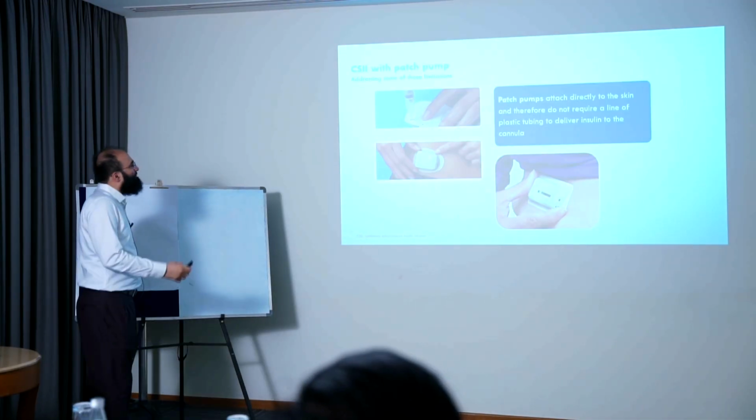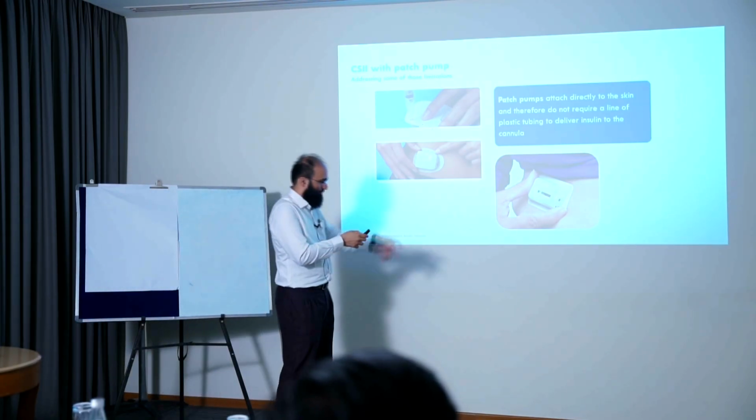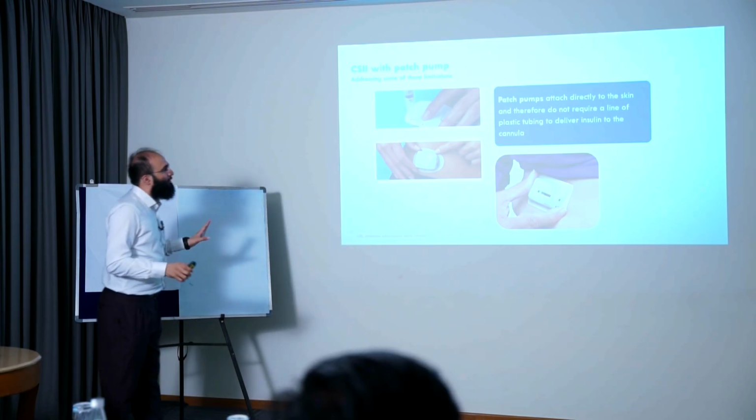And addressing some of those limitations, patch pumps attach directly to the skin. This is a patch. No tubing, nothing. The pump attaches to the skin, and therefore does not require a line of plastic tubing to deliver insulin to the cannula.